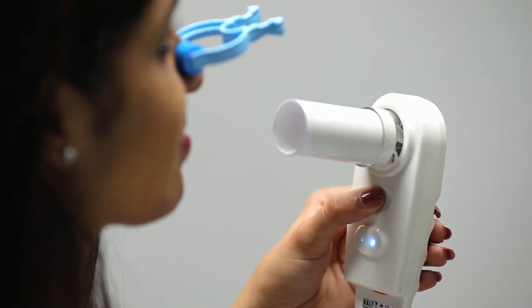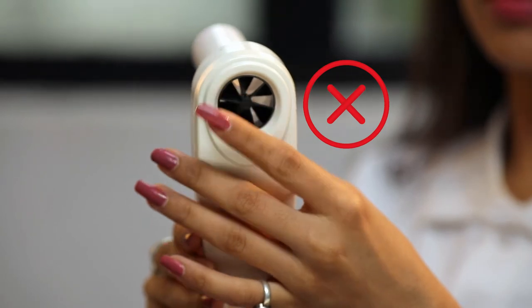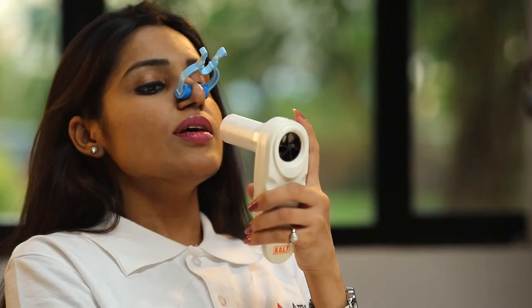LED facing you with one hand as shown in the video. Do not cover the blow fan with your fingers. Press the start button on the application. Take a deep breath until you can hold a full breath in your lungs.